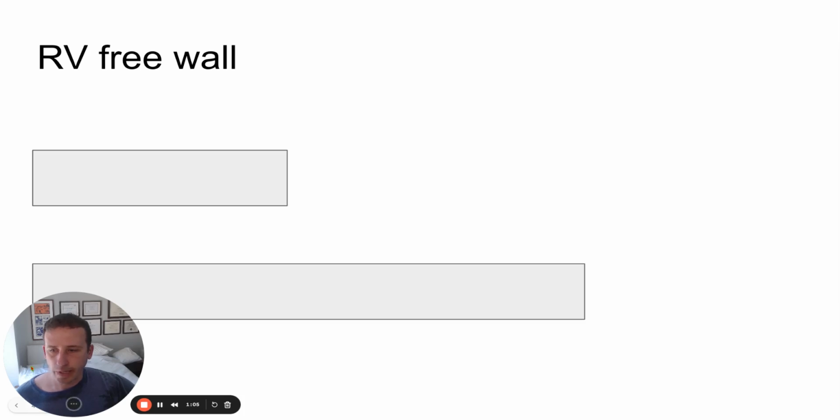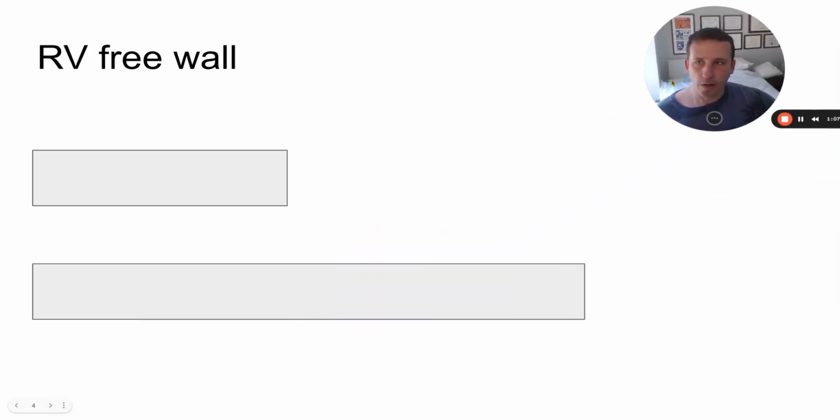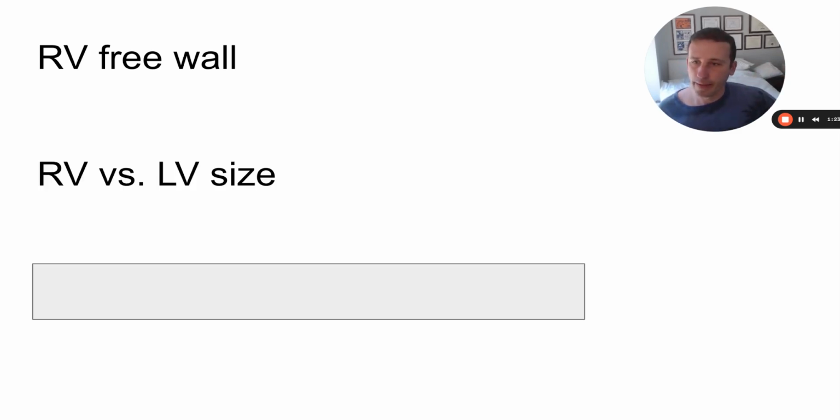So a few things that we can assess in this view, the RV free wall. If you're concerned that the RV is big, you can measure the thickness of that free wall to determine whether that's an acute or chronic finding, right? Is it an acute pulmonary embolism, or is this like pulmonary hypertension that's been there a long time?